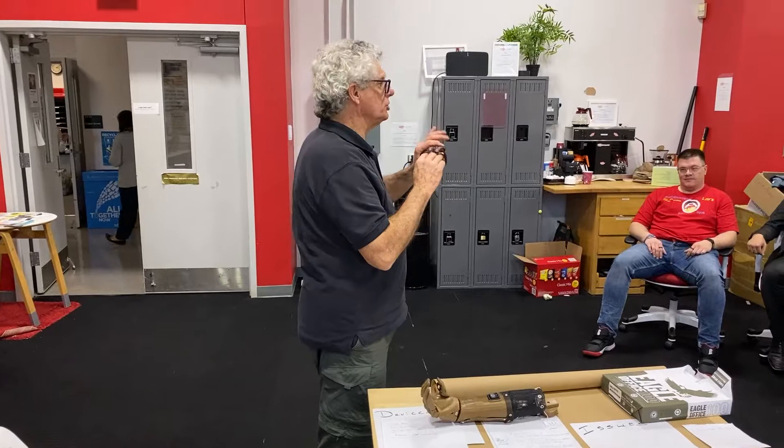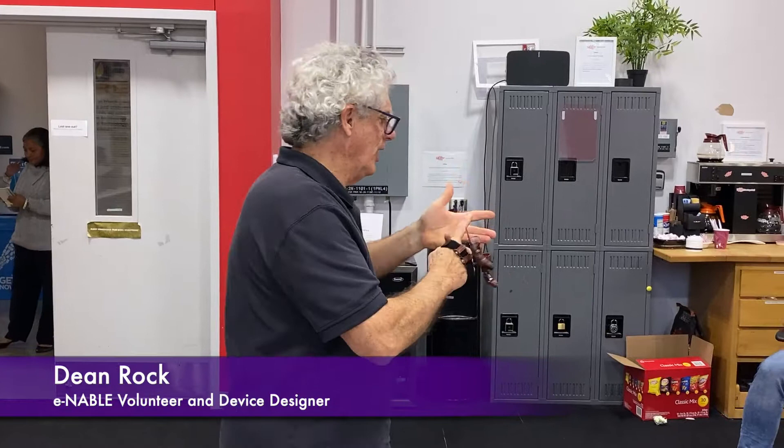First off, I'm going to show you a finger-actuated device. This is for an oyster fisherman. He got his fingers caught in a winch, tried to pull up traps, and he's amputated — that portion of these two fingers on his right hand.